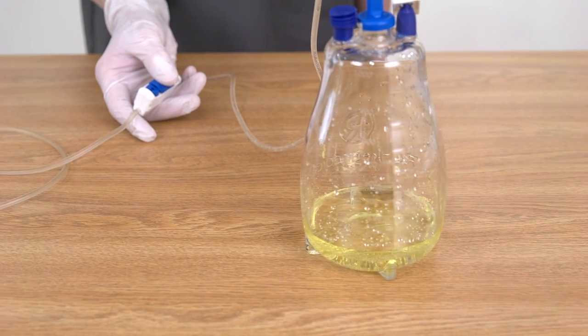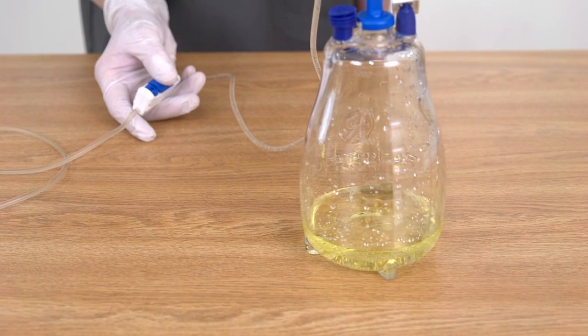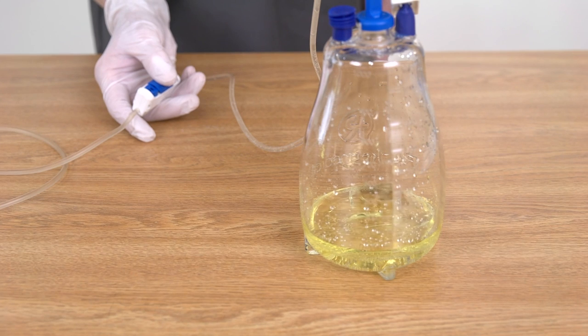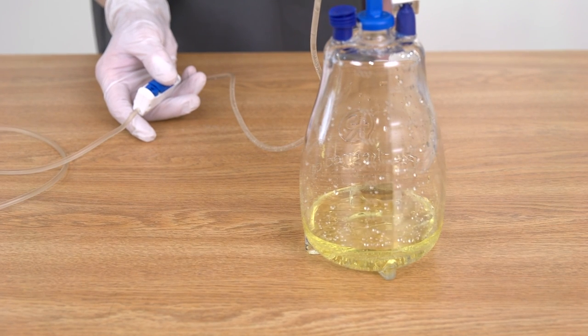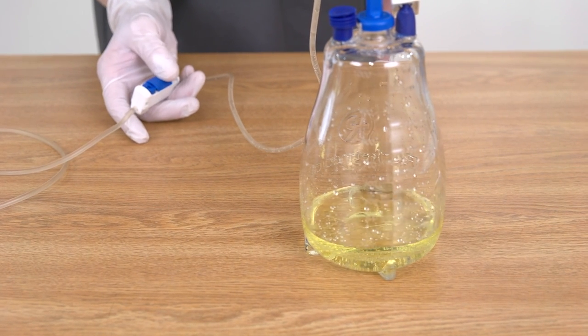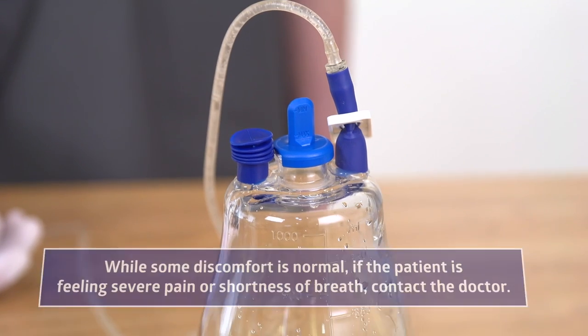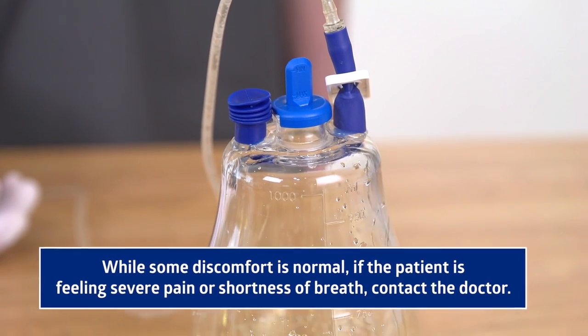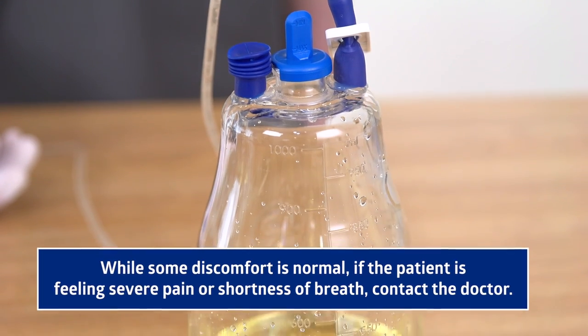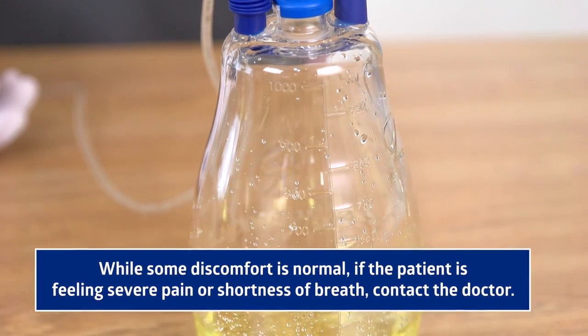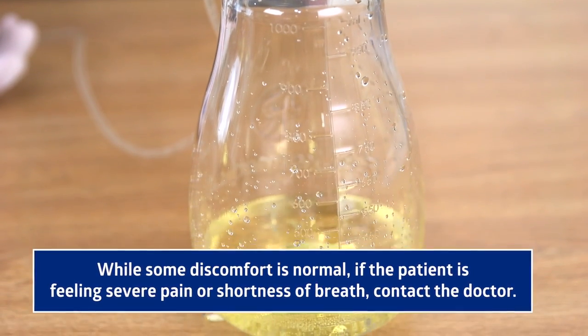If the patient experiences pain or discomfort, decrease the pressure on the button to reduce or stop the flow. To increase the flow, depress the button further with your thumb or use the slider. While some discomfort is normal, especially starting or ending drainage, if the patient is feeling severe pain or shortness of breath, contact the doctor.